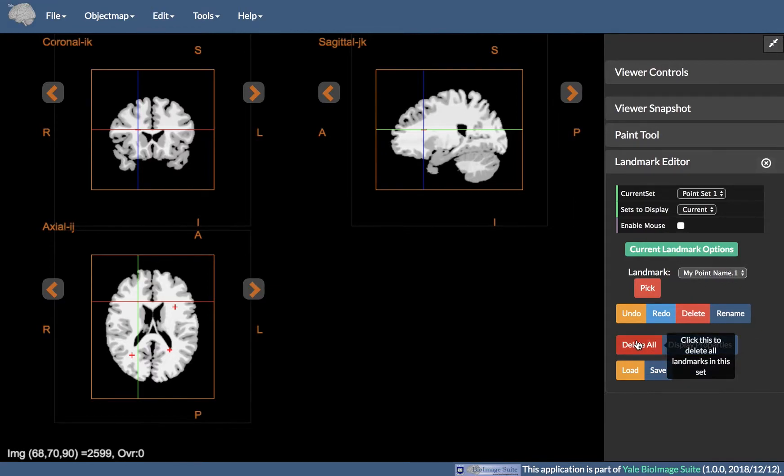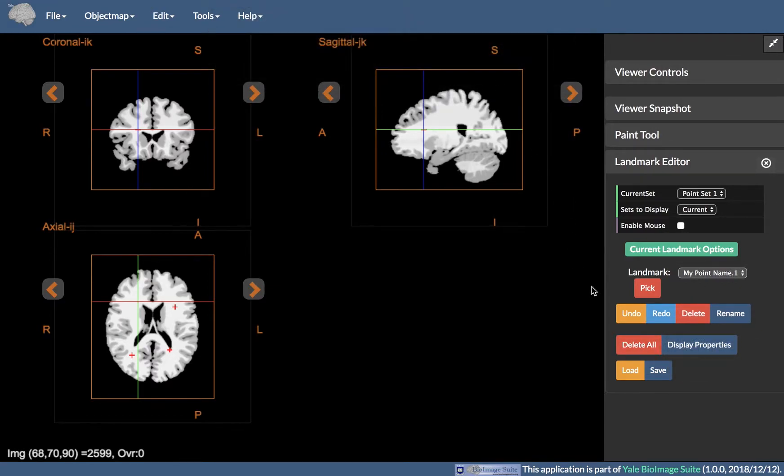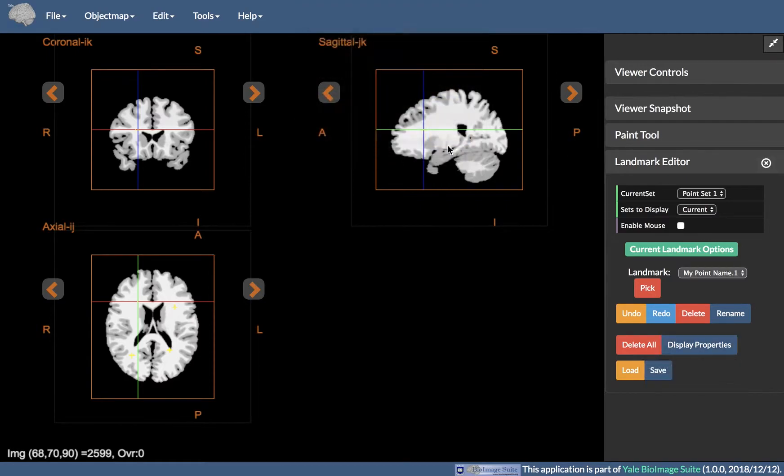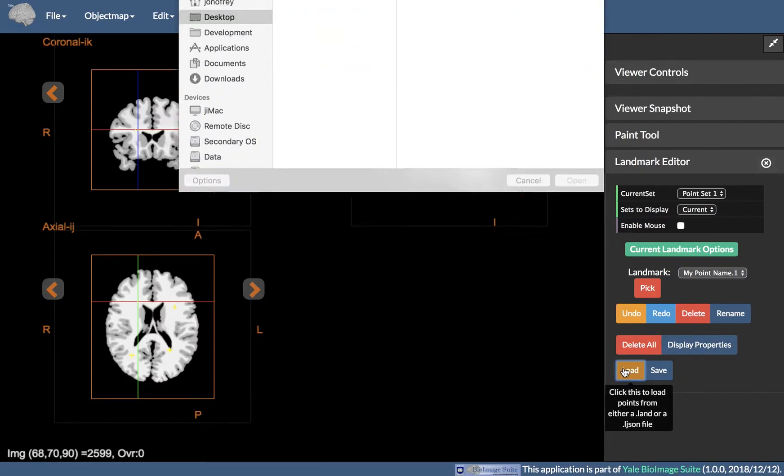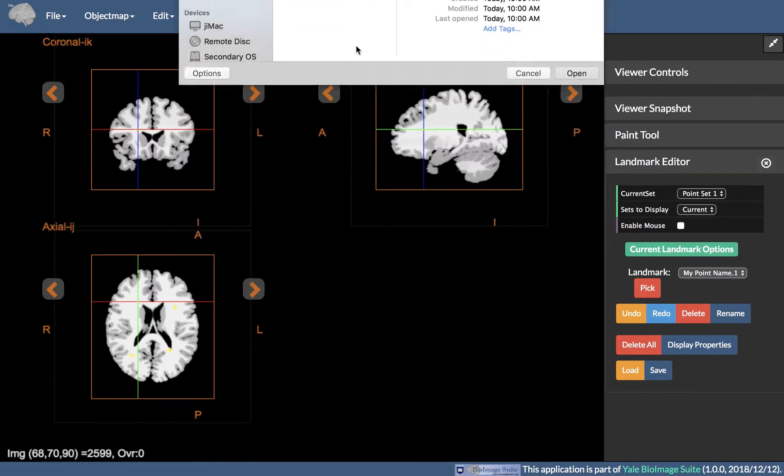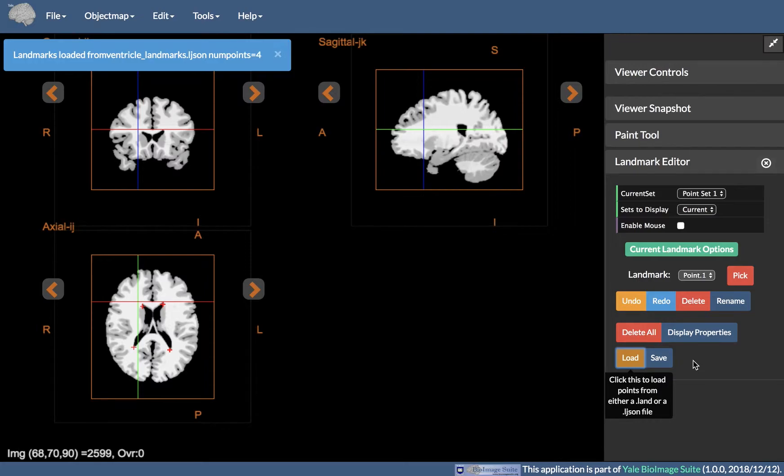Delete All deletes all landmarks in the current point set of Current Set. Display Properties selects the color of the point set in Current Set. Load can be used to load a previously saved set of landmarks. And finally, Save can be used to save the set of all landmarks.